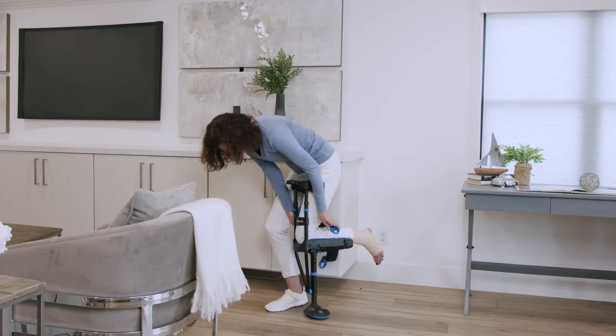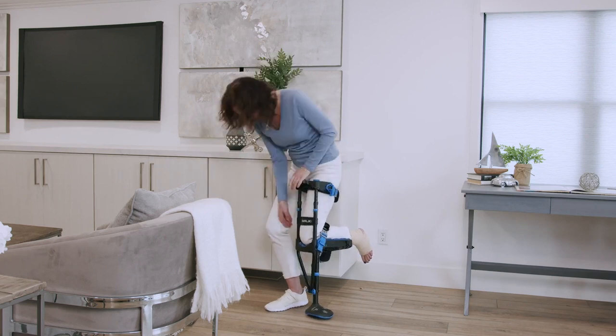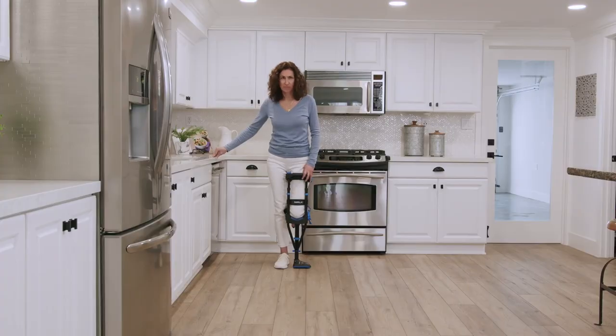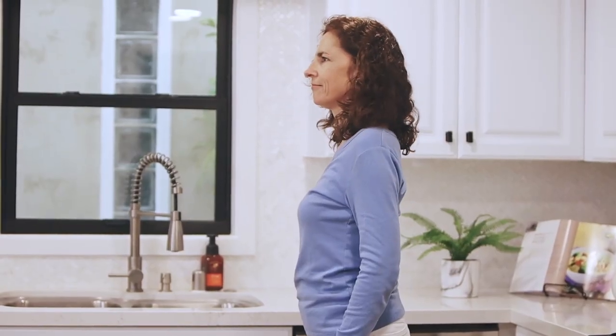Using a wall or handrail to steady yourself, put the crutch on. Make sure the straps are fully tightened. Stand with weight equally distributed on both legs, feet hip width apart. Keep your head up and avoid the temptation to look down.